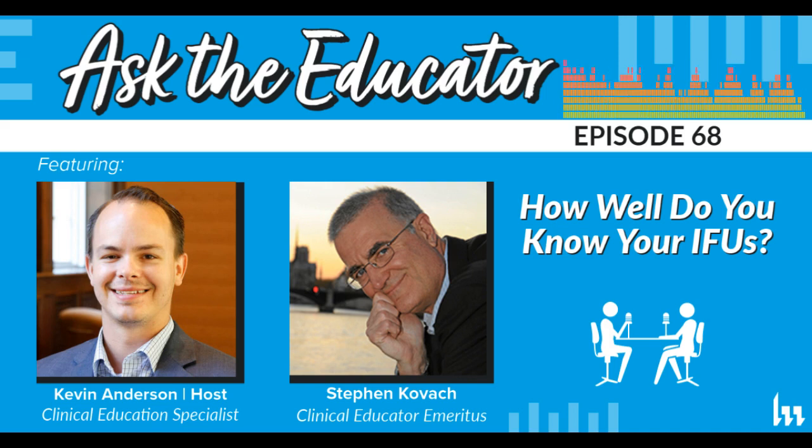It says these cords have been validated for 25 uses. I don't see people following the uses or marking them off on a tag or whatever. They also say it is recommended to establish a procedural review by which the cord's electrical continuity is regularly tested. I don't see that being done. Also, this is very interesting.